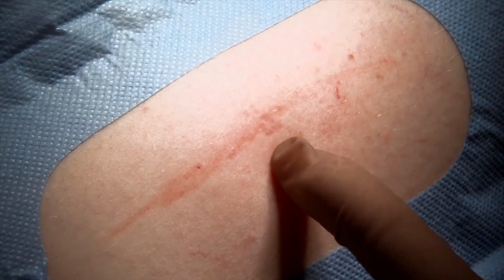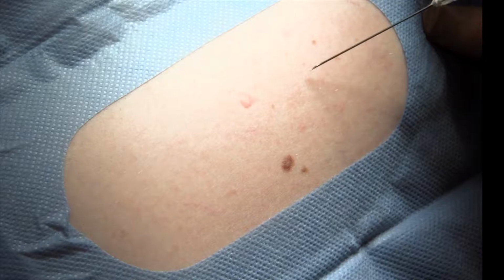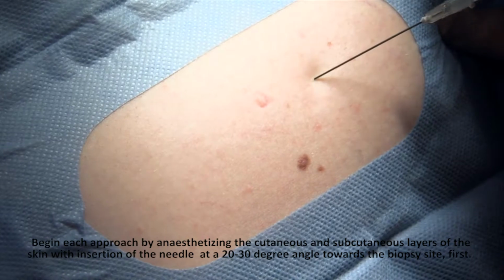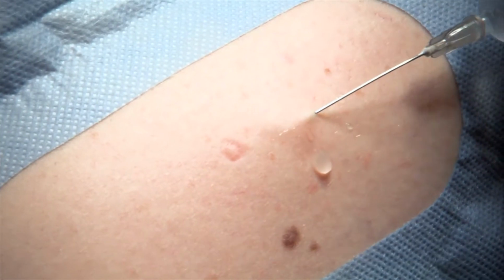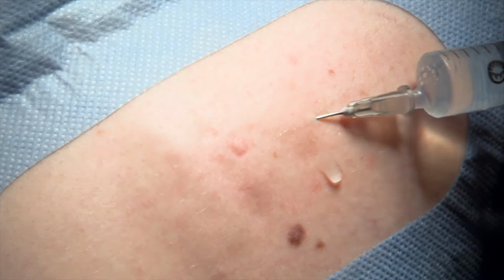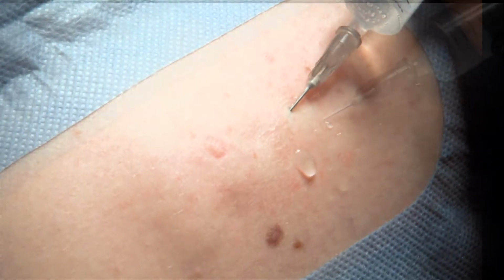Lidocaine is delivered to 4 areas for each of these approaches, with 1 to 2 mL delivered in each trajectory of the needle. Begin each approach by anesthetizing the cutaneous and subcutaneous layers of the skin with insertion of the needle at a 20 to 30 degree angle toward the biopsy site firstly. Then redirect the needle to 2 centimeters medial to the biopsy site, and then, withdrawing again, redirect the needle 2 centimeters lateral to the biopsy site.